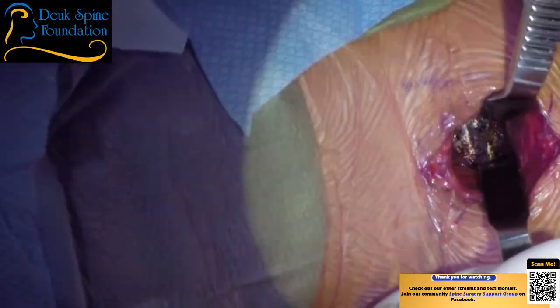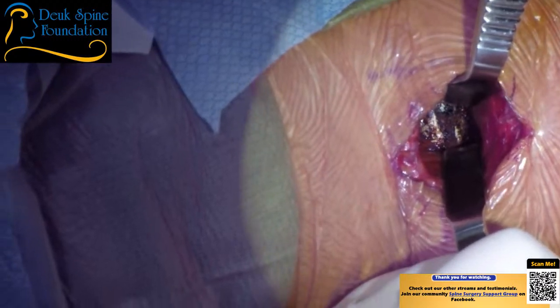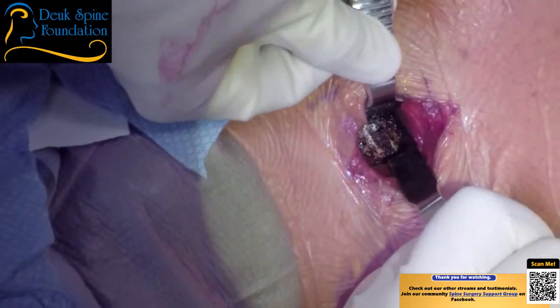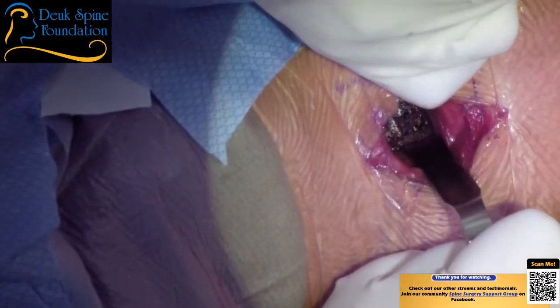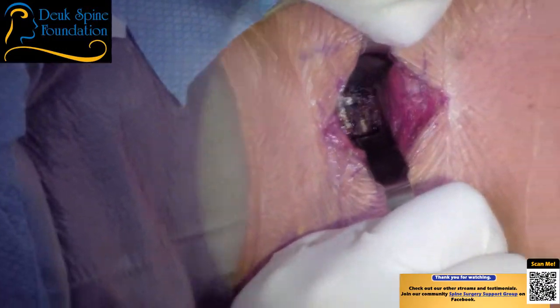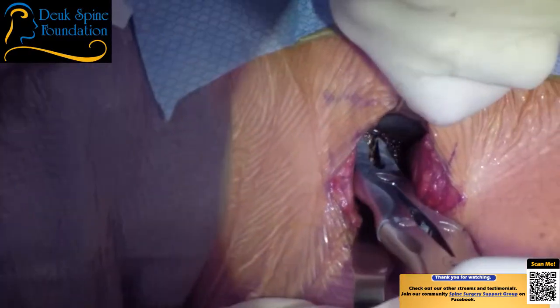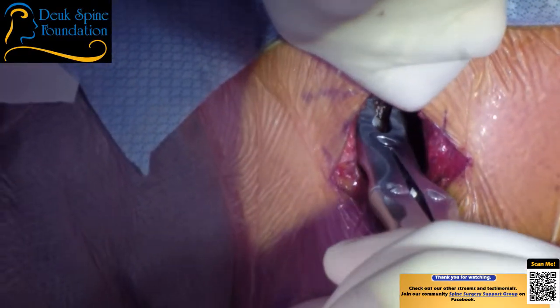All right, good. You all see that? That's the disc right there. That's the front of the disc, and actually there's a little bit of bone spurring. Hold that there. Push down and hold it. Don't let it slip. Large bite. Yes, sir. So to get rid of some of the bone spurs, we usually take a large bite and bite them off. Otherwise, the metal plate we're going to put in won't sit on the spine properly.